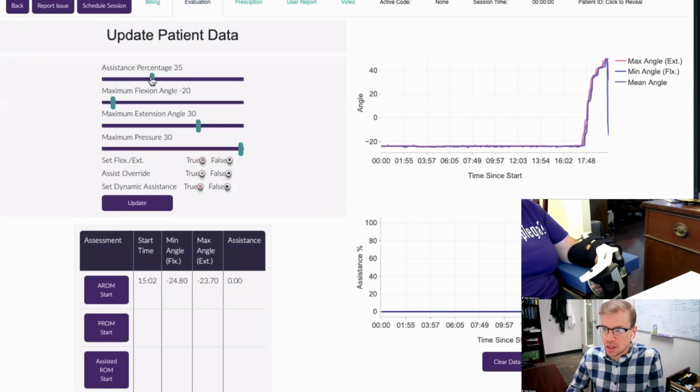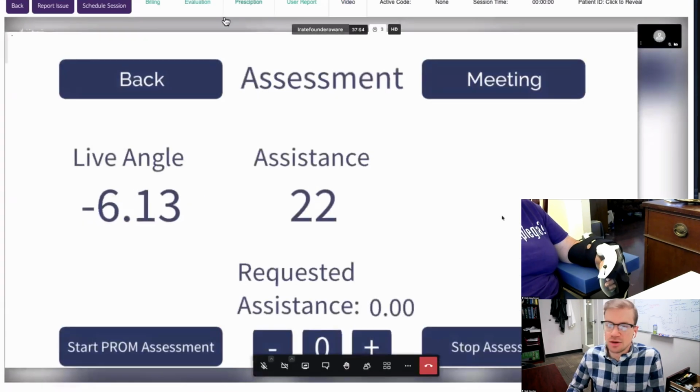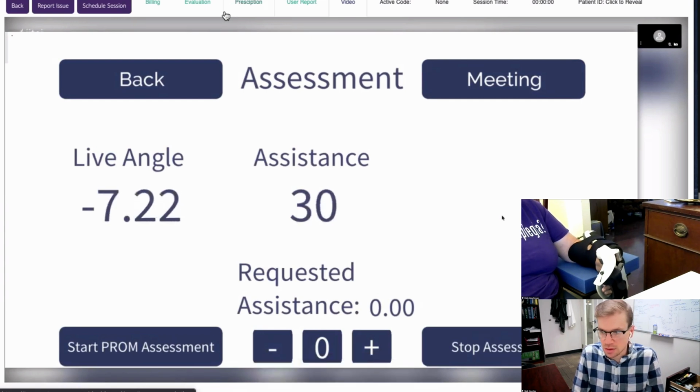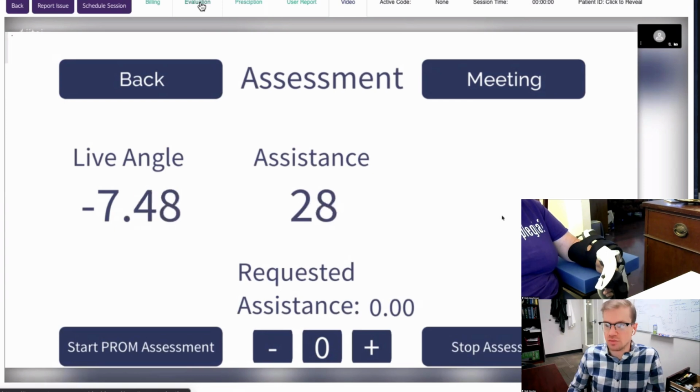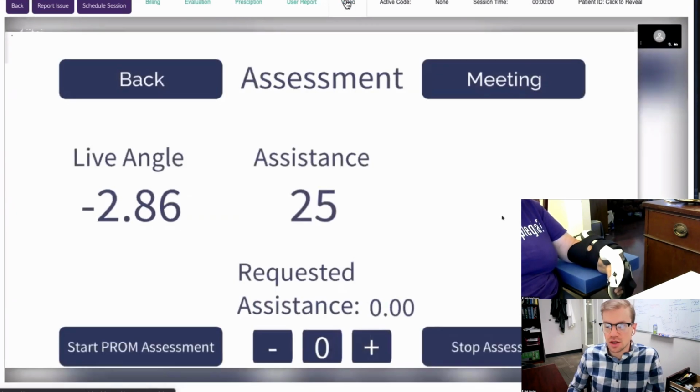So now I'm going to put a little bit of assistance in here. Just relax. Okay. A little bit of assistance there. And I'd like you to flex down against this for me. So go ahead and flex as far as you can. Great. And then I'm going to have you move up as far as you can. Great. So that's interesting, Paul. You see that?